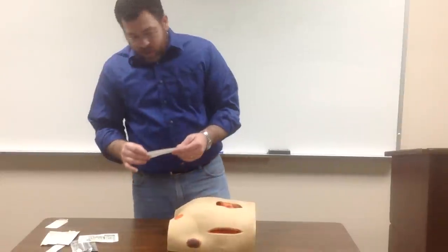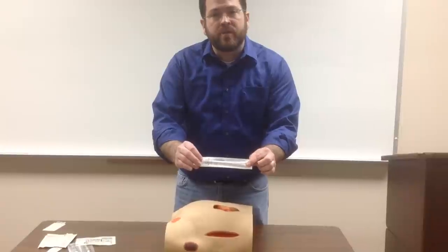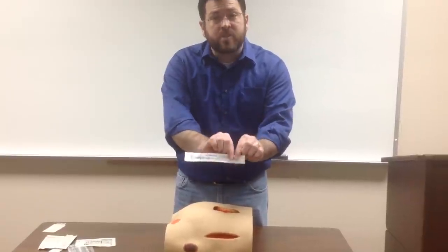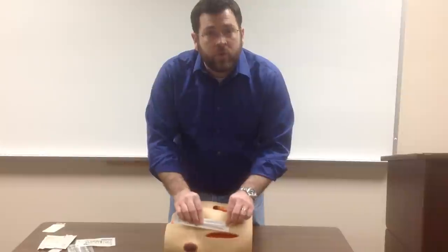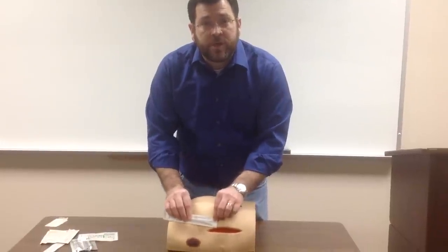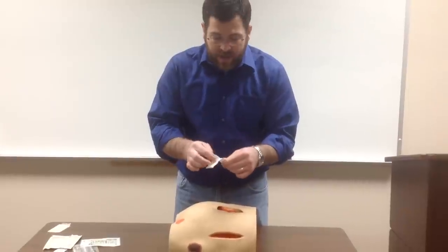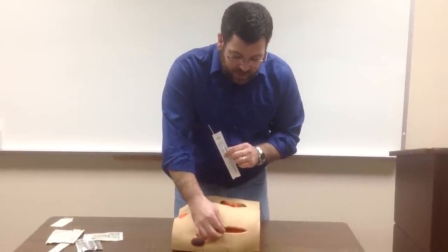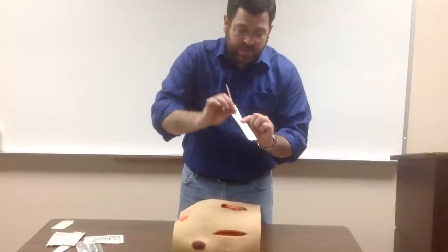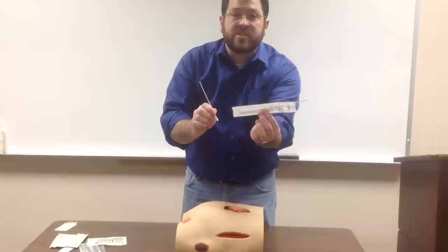A couple of things I'll show you also — as far as measuring wounds — most of these cotton tip applicators have scores in centimeters across the bottom of them, and you can measure your wounds using those. You can measure length, width, and depth. If you take out the applicator, you can put it down into the wound to see how deep it is and use that to measure depth. So these a lot of times have markings for measurement.